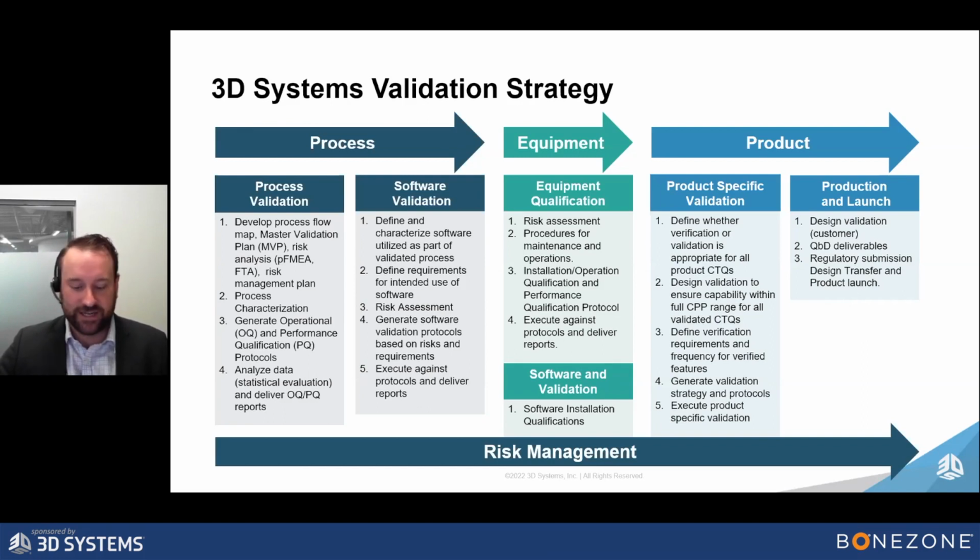What the full factorial design of experiments allows us to do is really understand what our first and second level interactions are, so that we can build out an operational qualification or an OQ that really is in worst case conditions. Then it moves to a PQ, typical PQ, series of shutdowns and startups over a number of shifts through the analysis of data.